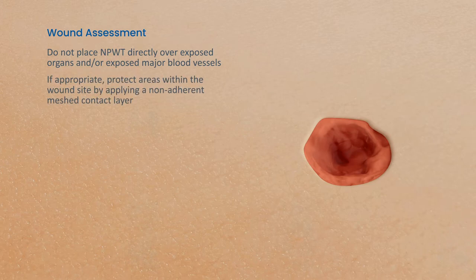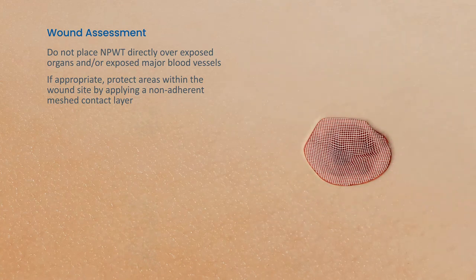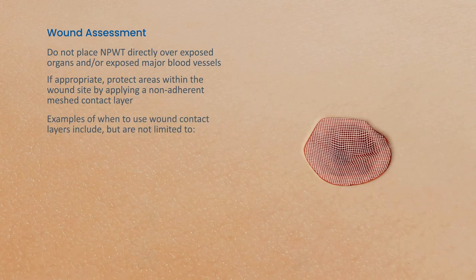If appropriate, protect areas within by applying a non-adherent meshed contact layer. Examples of when to use wound contact layers include, but are not limited to, skin grafts, flaps, and sutures or staples.